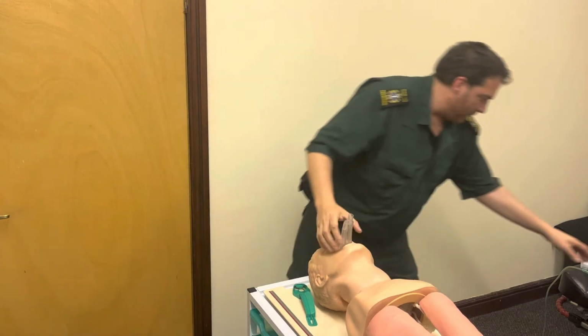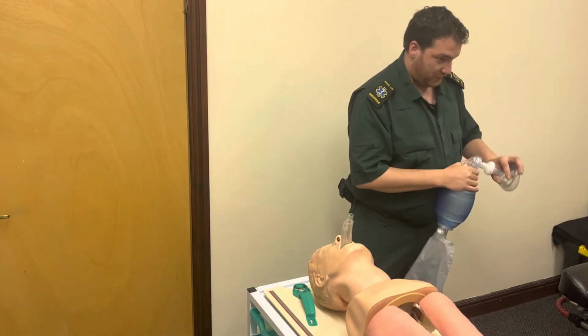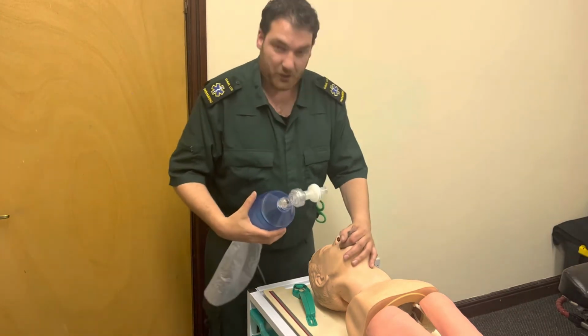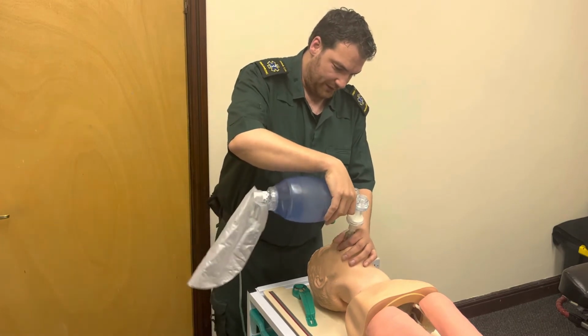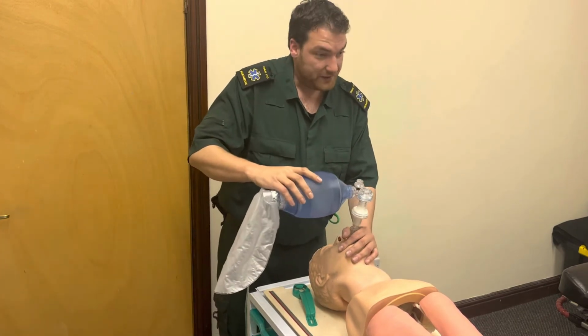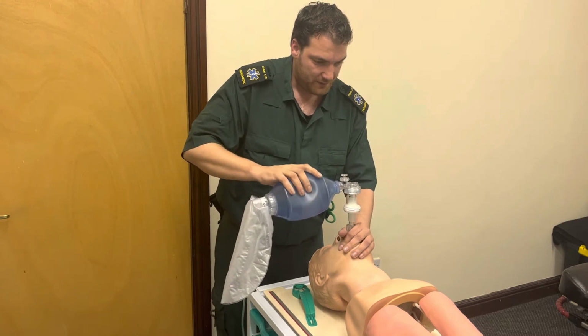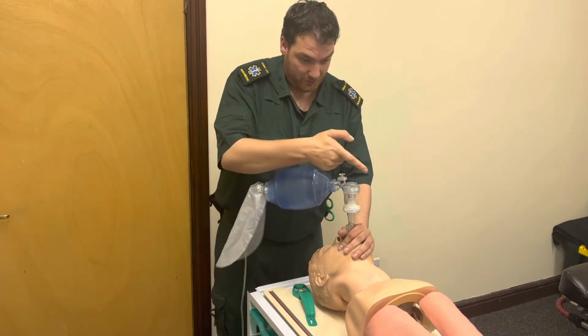All right. Now I use the bag valve mask I had earlier. You're doing a good job, by the way, in compressions. And I'm going to test it. So I'm putting this in like so, and I'm going to say, can you please stop compressions? And then test it. 1, 2. Excellent. Back on for me.